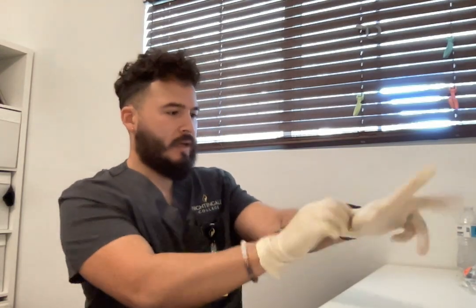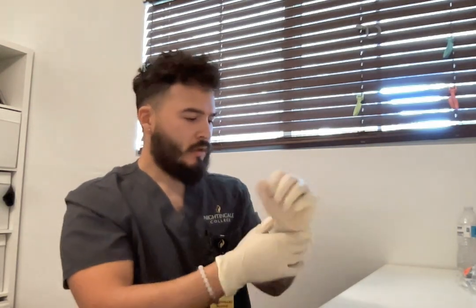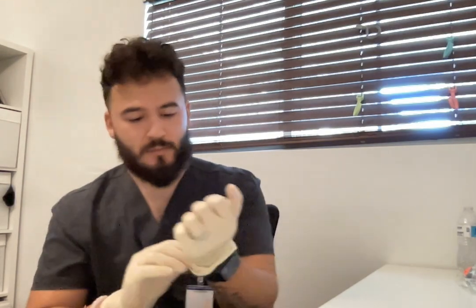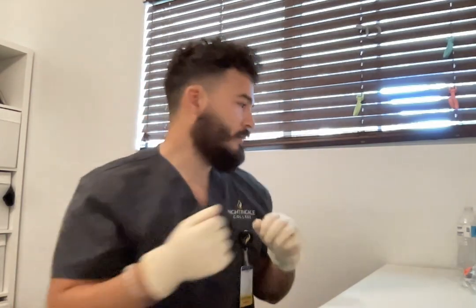Okay, now that I have my gloves on, I've introduced myself, provided privacy, checked the allergies, and have the 2 identifiers. Before giving medication, I want to ensure the 6 rights of medication. So I want to confirm it's the right patient, right medication, right dose, right route, right time, and then also right documentation. So now that all checks out, I am ready to set up the IV.